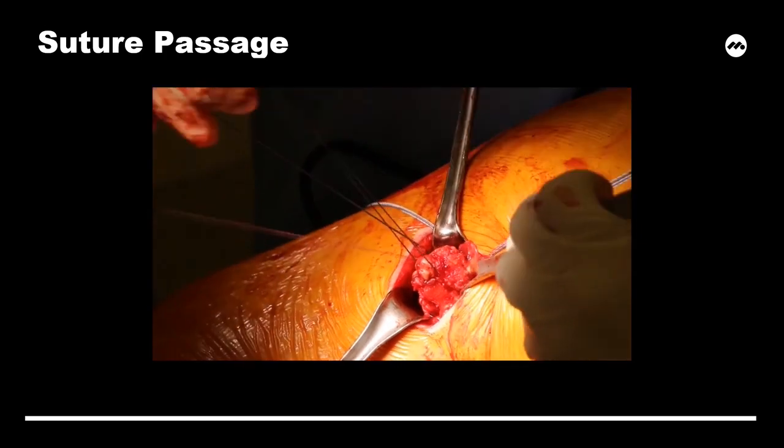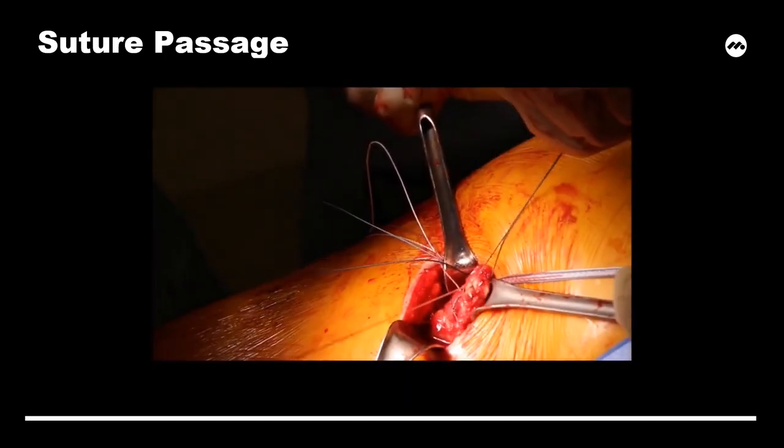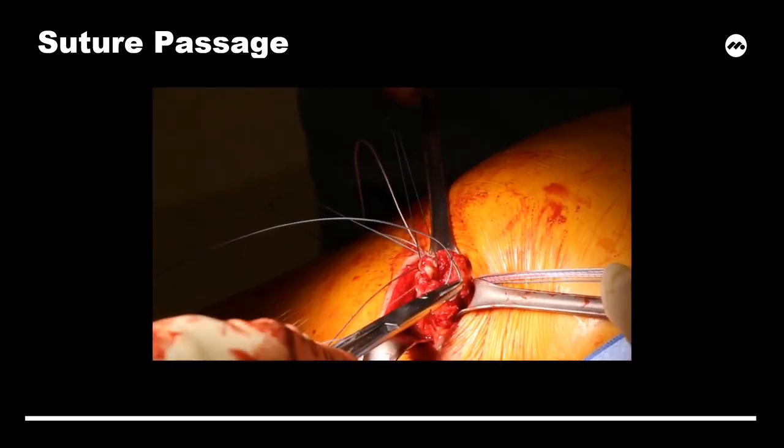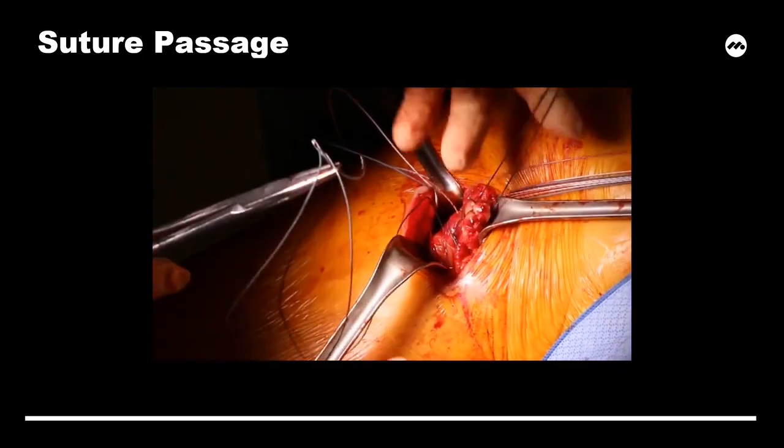After anchor placement, the retractors are then removed to decrease wound tension during suture passing. The traction sutures are utilized to apply additional tension on the tendons. We began passing sutures from the posterolateral anchor. One end of each suture strand is identified as a post strand, and the non-post strands are passed through the tendon on the lateral side.